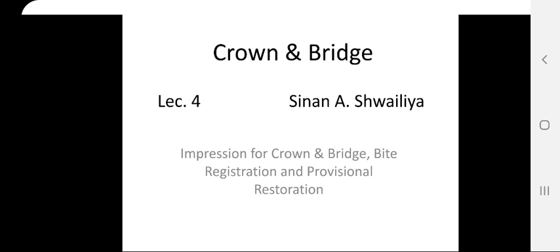راح نشوف بهذه السلايدات القادمة بعض المعلومات عن الامبريشن فور كراون اند بريدج، وشلون ننقل هذا وضع الأسنان البريبير تيث والadjacent structures إلى dental laboratory for construction of a fixed crown and or a bridge.